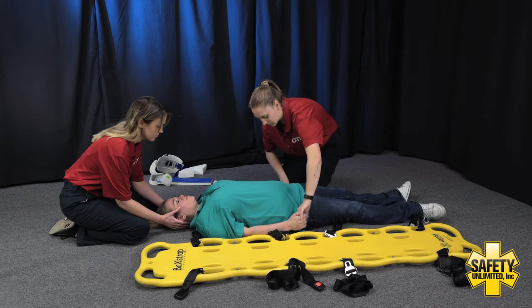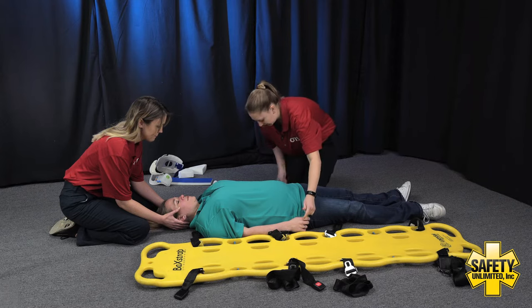Patient, can you squeeze my fingers for me? And which finger am I touching? And which finger am I touching?